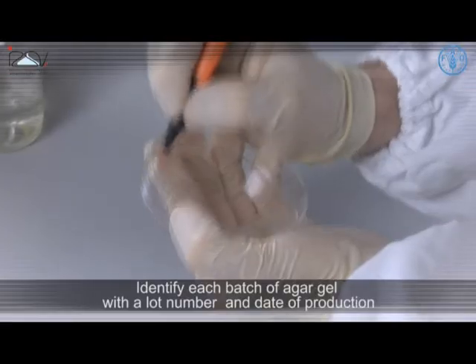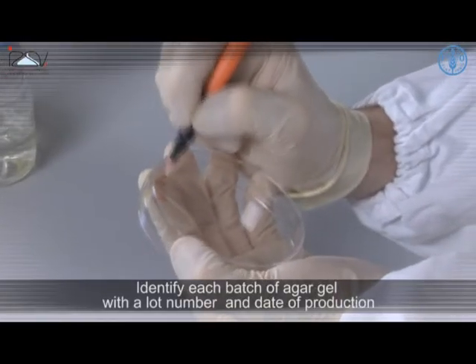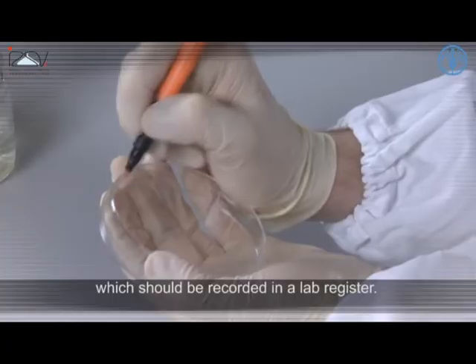Identify each batch of Agar Gel with the lot number and date of production, which should be recorded in a lab register.